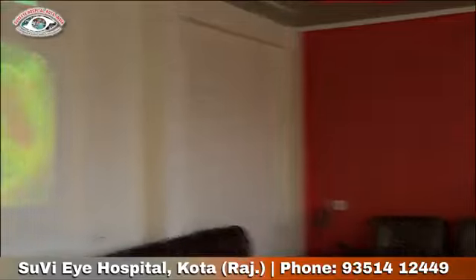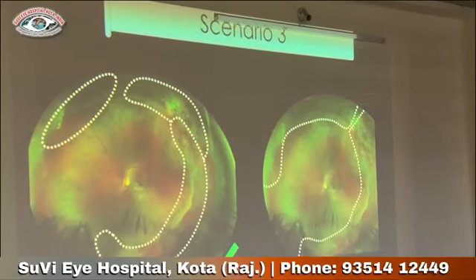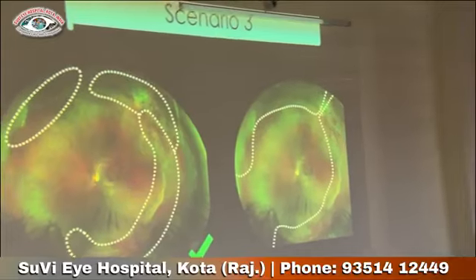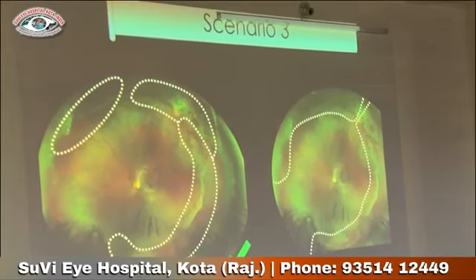Sometimes in case of Stickler syndrome, there is a 360 circumferential cerclage. So that is also there. But yeah, this is the better way to proceed. You can do a 360 degree also, but then you need to connect to the ora. You can do a 360 degree, but this is the better way if you can do the individual covering.